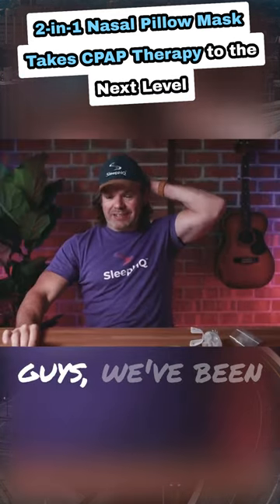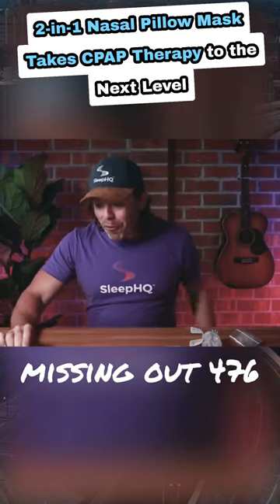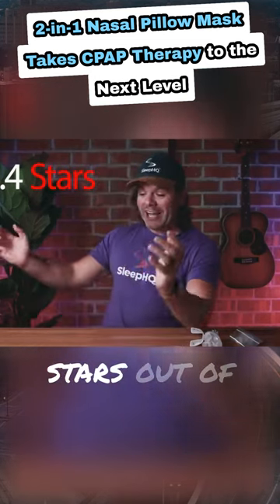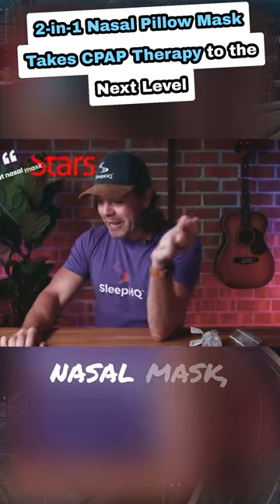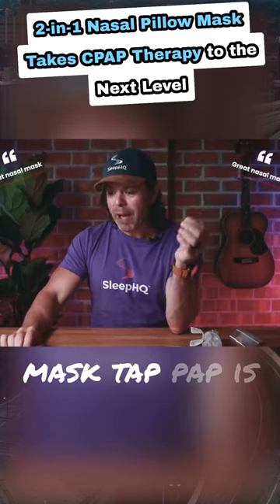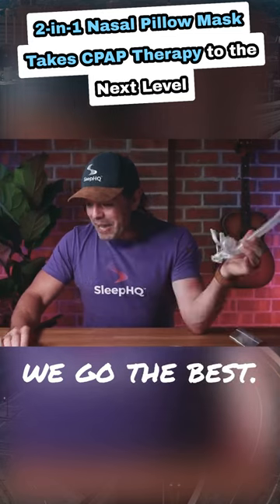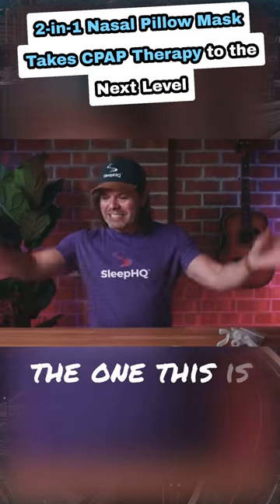Guys, we've been missing out — 476 reviews, 4.4 stars out of five. 'Great nasal mask.' 'Tap-Pap is the way to go, works great.' 'No straps, no face mask.' 'The best — finally found the one. This is it.'